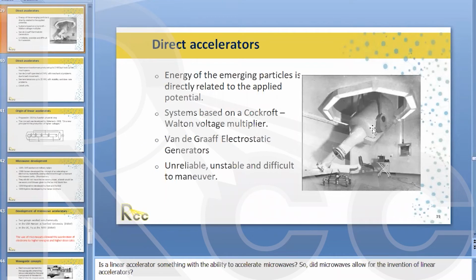Next question. All right. Thank you again, Frank. This one comes from Kwame. If a Cobalt 60 source reaches its half-life, is it advisable to use it for a period of time before changing the source? Okay, very good question again.